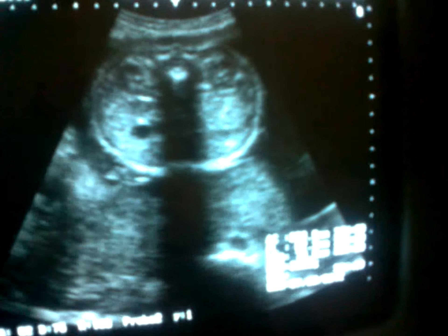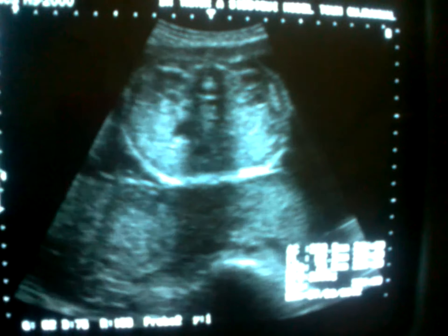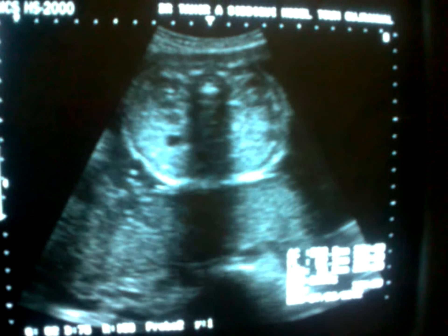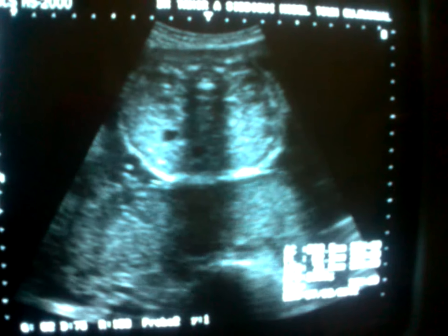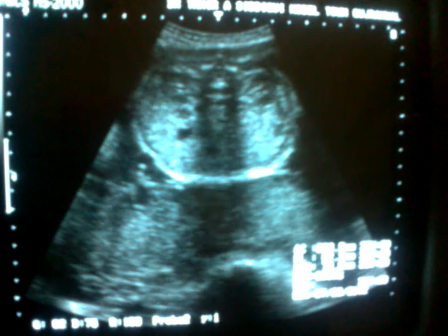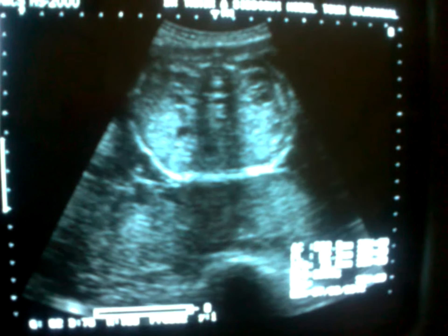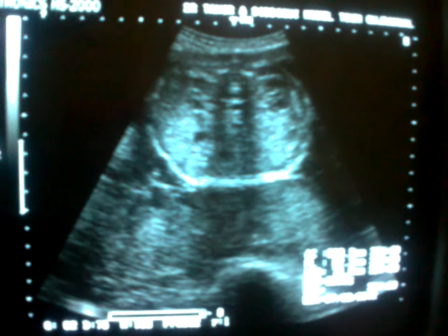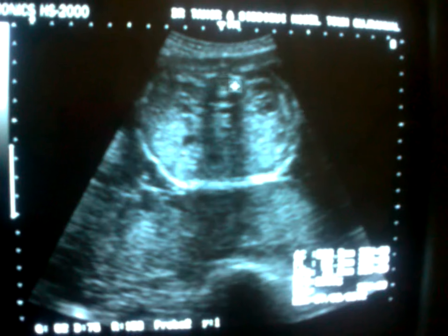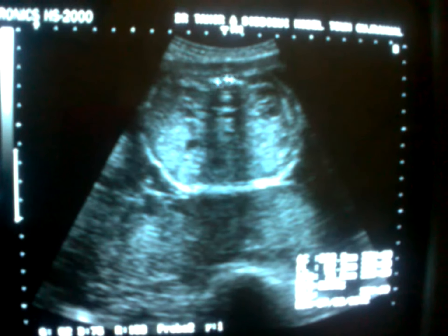This is the transverse view of the 32-week fetus. This is the transverse section of the abdomen of the fetus with the vertebral column vertebra visible.